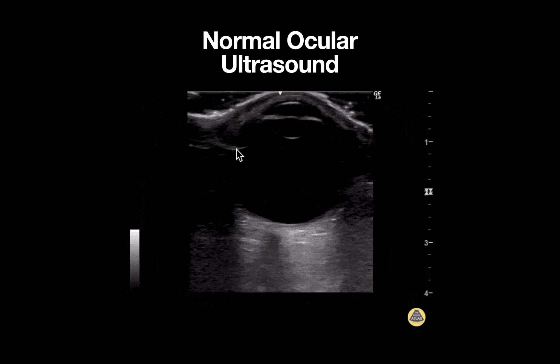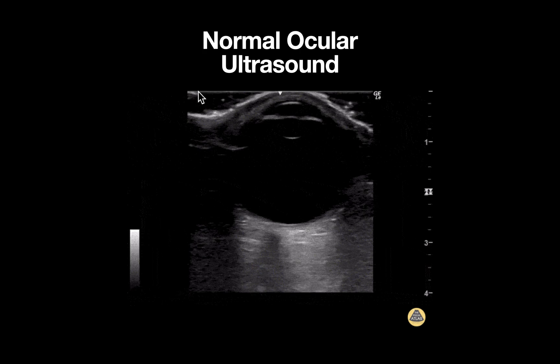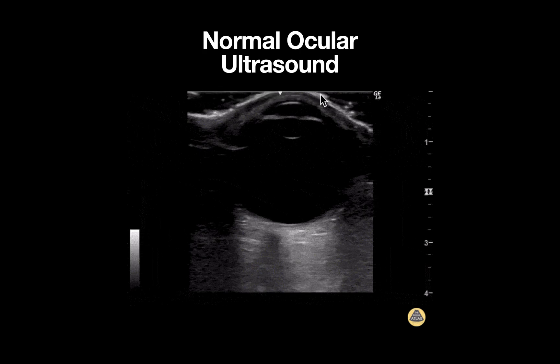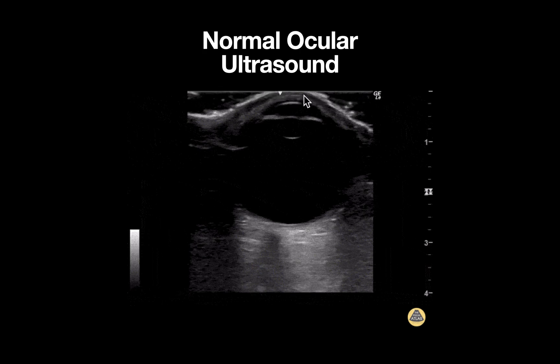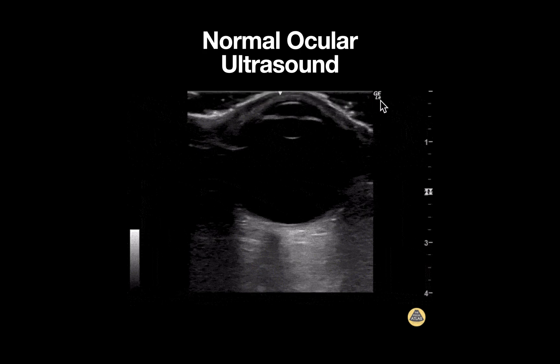This is an ultrasound clip demonstrating normal ocular anatomy. A linear probe is used, as delineated by the shape of the footprint at the top of the screen.